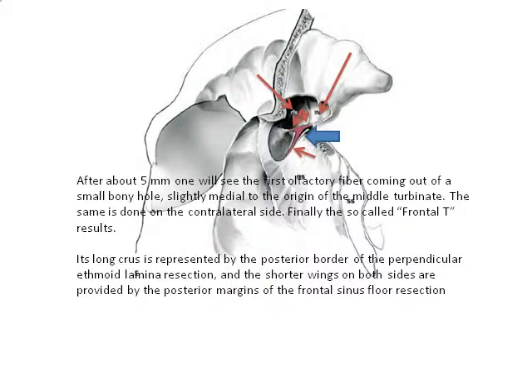The median drainage procedure, or Draf 3.